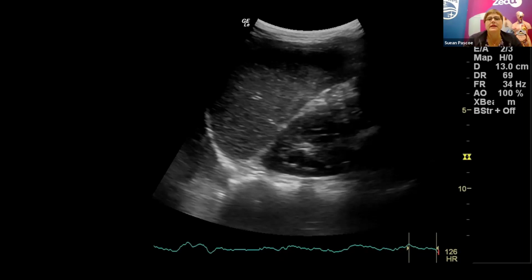So now, after we've looked at those things as a brief glance around the edge of the picture, we get to the diagnostics bit. The philosophy behind this is, if you haven't got a good image, you can't possibly get a good diagnosis out of that. If your image, like this one, is really dark in that near field, I can't be sure whether that might be a splenic injury or a liver injury. I don't even know if this is left or right, so it could be either. Is that pathology or is that a gain setting? That's when you start to ask, is this diagnostic? If you haven't got your imaging parameters set well, then you're not going to come up with the right diagnosis.